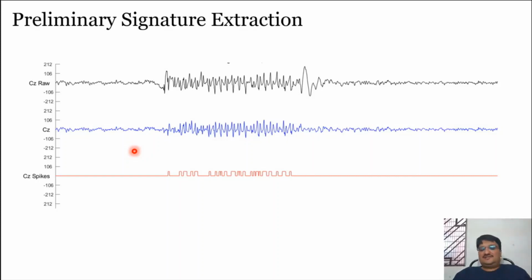So all this noise can be physiological as well as non-physiological. It can be due to some issue inside your body, or it can be due to some environmental factor. Like if EEG is being recorded in India, then there is 50 hertz power line artifact, whereas the artifact observed in the US will have 60 hertz frequency. That's one artifact. Whereas if a person is moving, if a person's eye is blinking, if you move your eye, then also there will be an artifact which should be rectified.